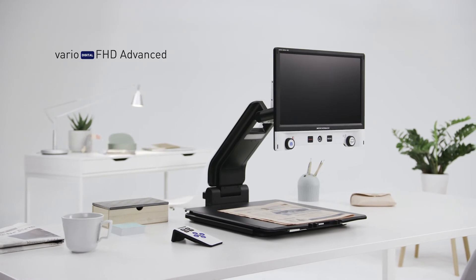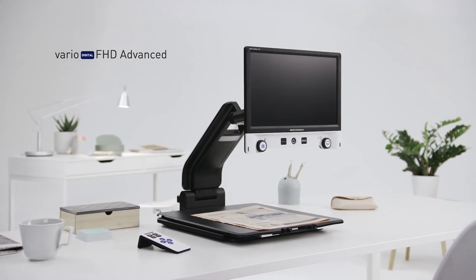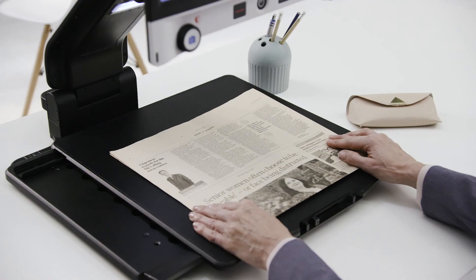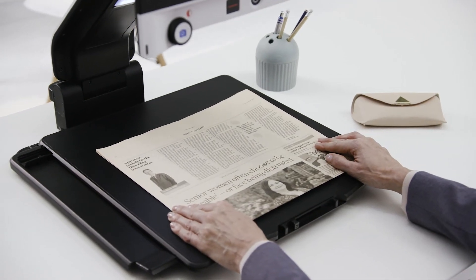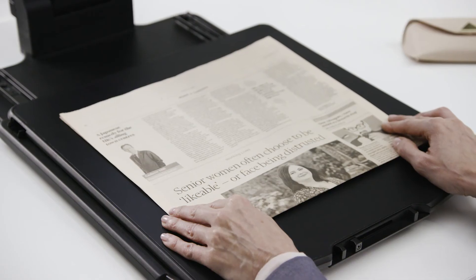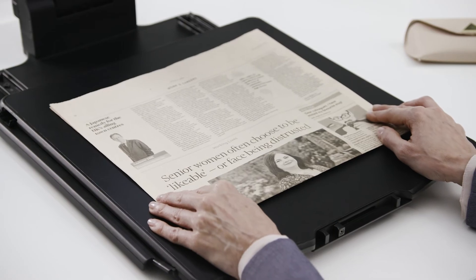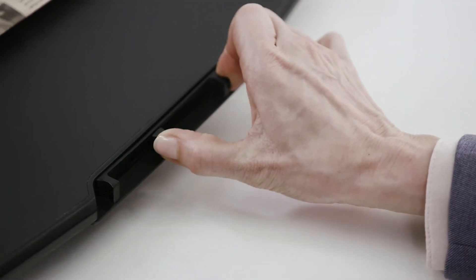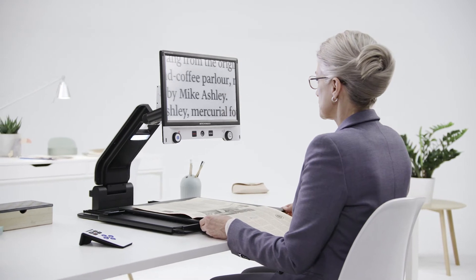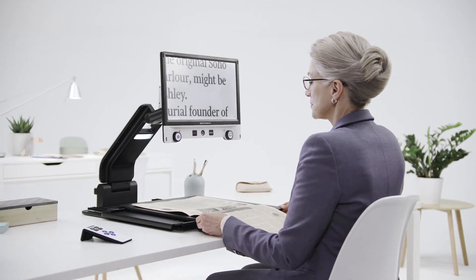The Vario Digital FHD Advanced has additional features for extra comfort and mobility and is also available with an XY table. With its adjustable brakes for both the X and Y direction, the optional table enables users to adjust the direction of the table's movement for more comfortable reading in the case of high magnification levels or large reading areas.